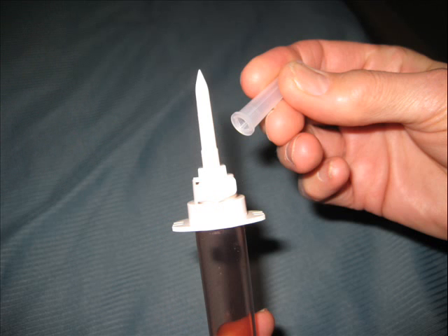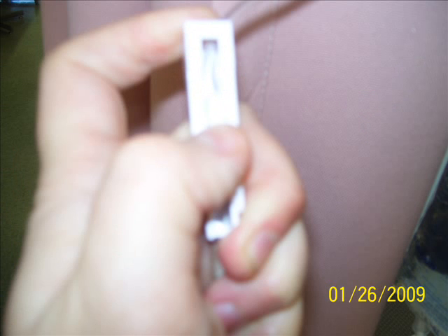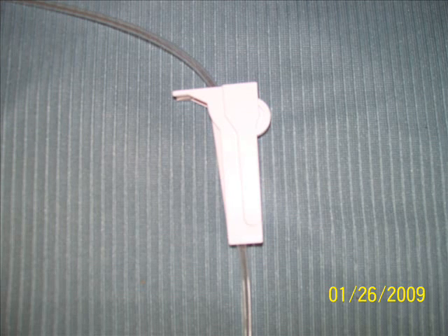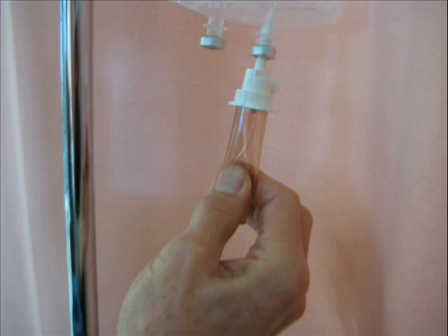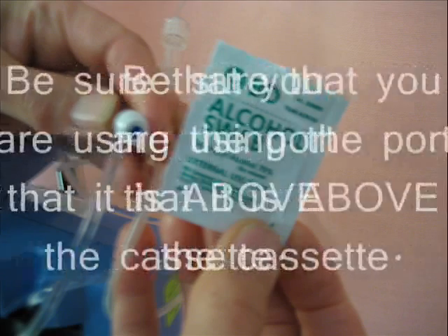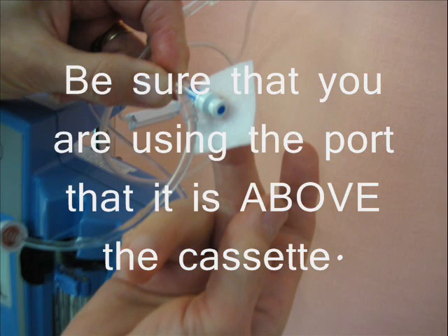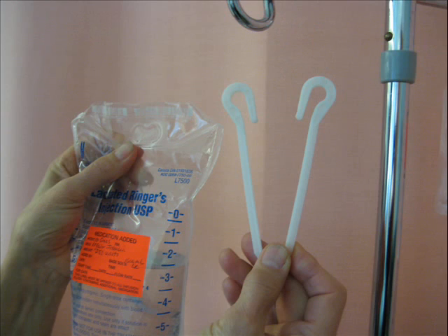We can start to prime the secondary line: first take the cap off the same way as before, spike the bag, press the chamber, and open the roller clamp — at this moment it is open. Before we press the chamber we have to be sure it was closed, otherwise fluids will go through in an uncontrolled way. So we press the chamber and when it is primed we are ready for the next step.